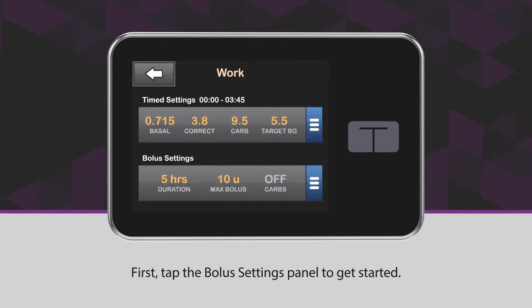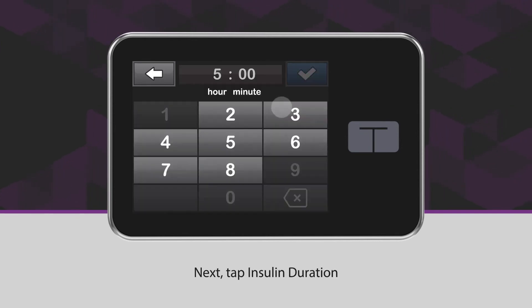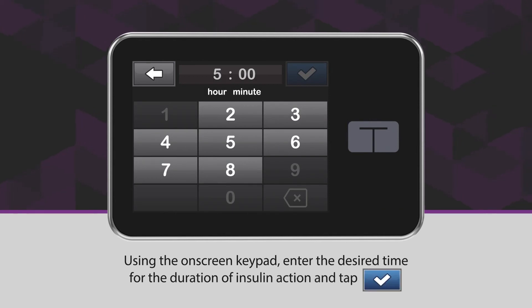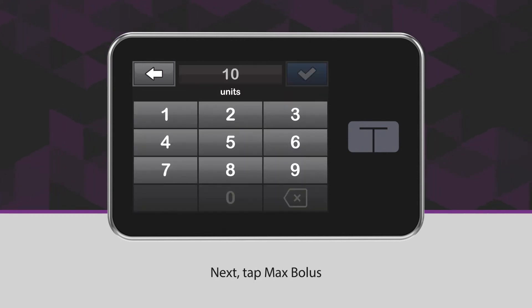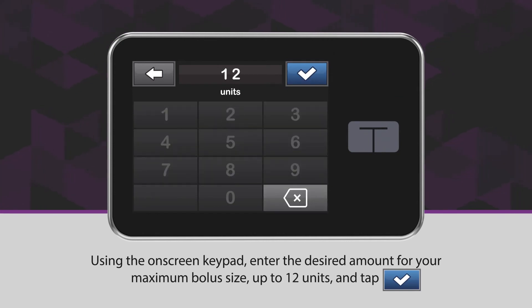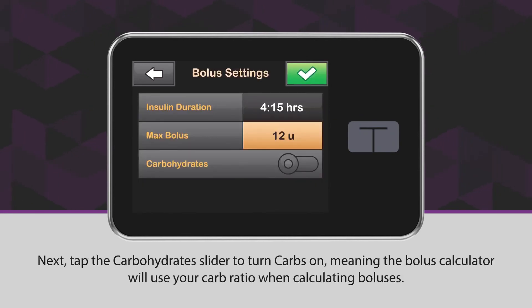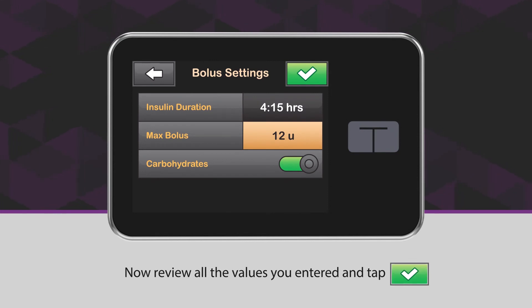Tap the Bolus Settings panel to get started. Next, tap Insulin Duration. Using the on-screen keypad, enter the desired time for the duration of insulin action and tap the blue checkmark icon. Next, tap Max Bolus. Using the on-screen keypad, enter the desired amount for your maximum bolus size, up to 12 units, and tap the blue checkmark icon. Next, tap the carbohydrate slider to turn carbs on, meaning the bolus calculator will use your carb ratio when calculating boluses. Now review all the values you entered and tap the green checkmark icon.